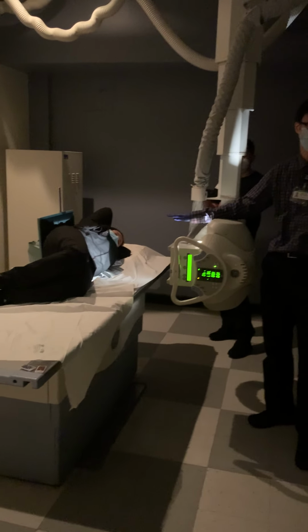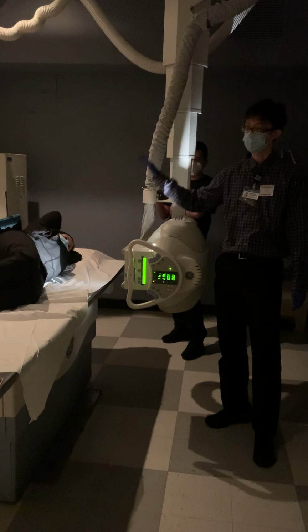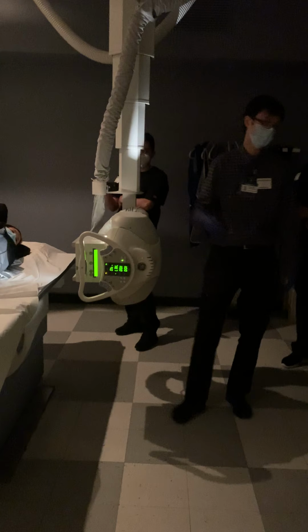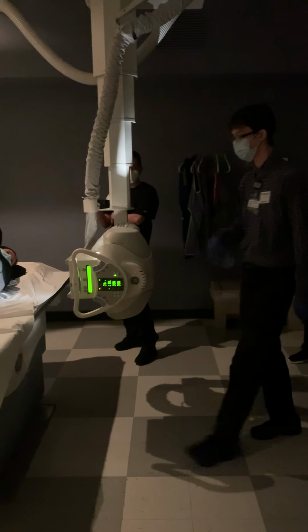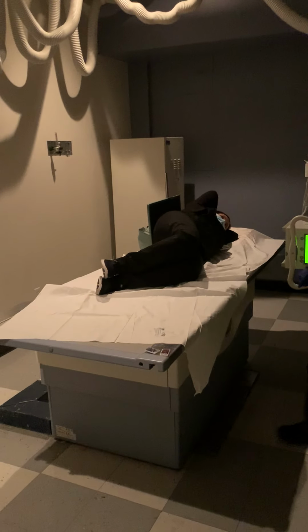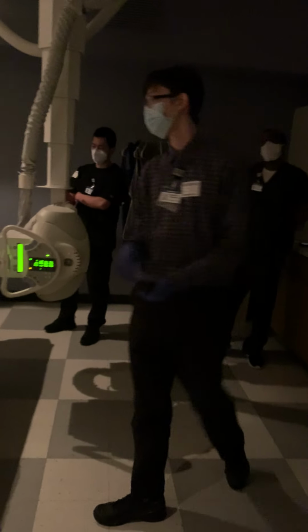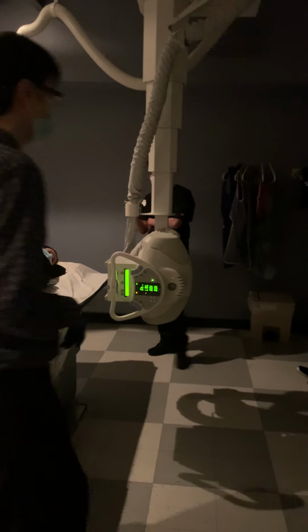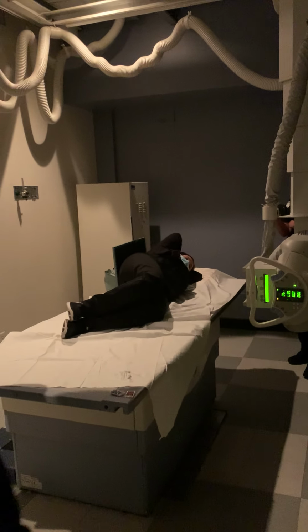If you were doing this in a patient's bed, for example, so if you couldn't bring a patient down to the department, if you had to do this in a patient bed, the patient bed is usually a lot softer than this. The patient sinks into the bed. So in that situation, you would need to find something hard to kind of raise the patient back up.